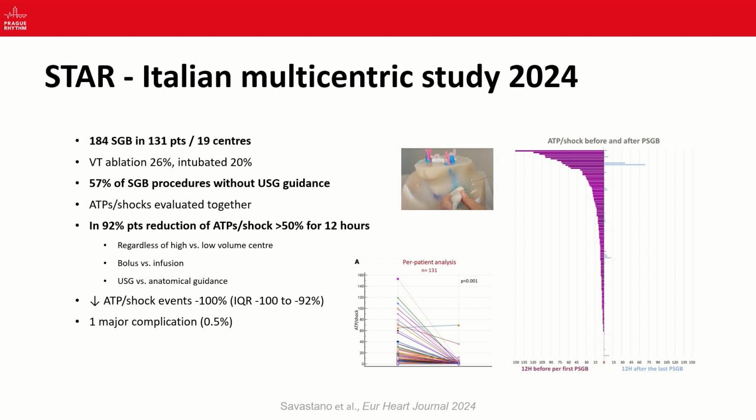What is also interesting about this registry is that more than half of the procedures were performed without any ultrasound guidance, only based on anatomic landmarks, which is considered by some pain management physicians to be an obsolete method. Nevertheless, they observed only one major complication.